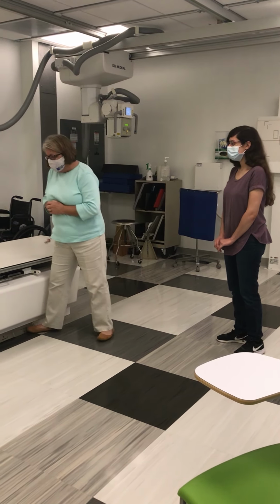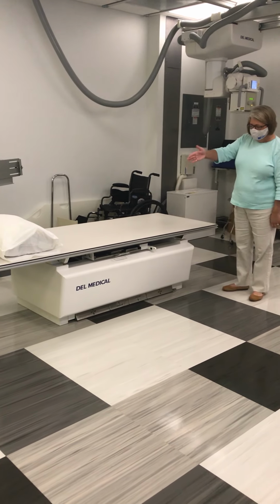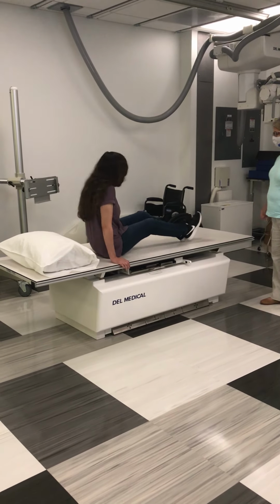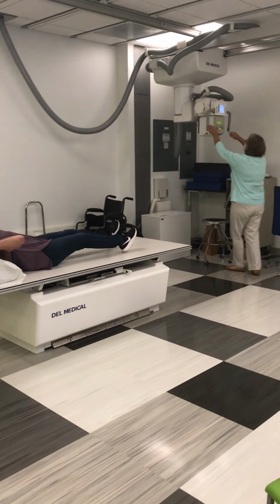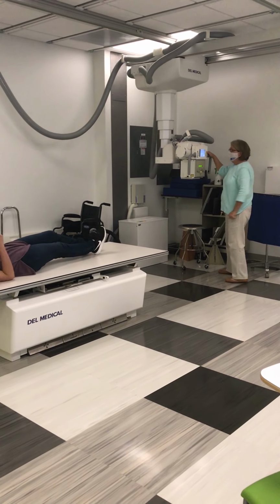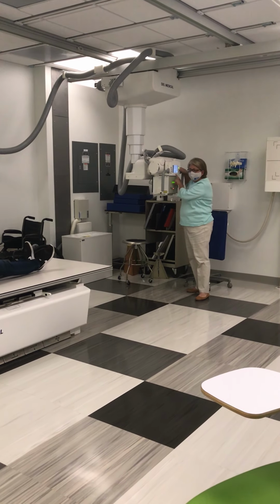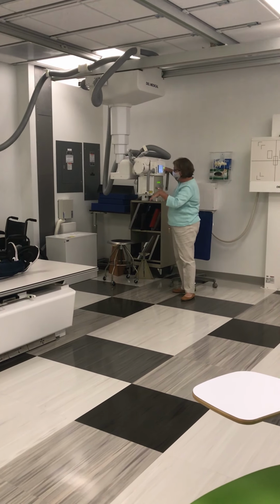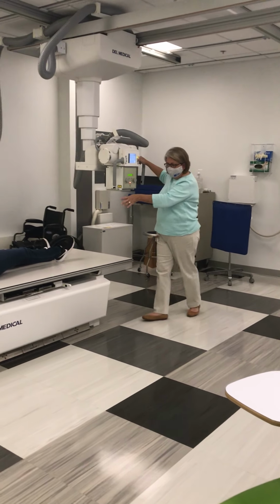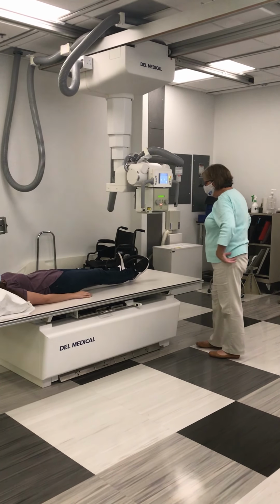I want to make sure that my table is lowered completely for patient safety. Ma'am, if you would, lie on the table on your back with your head on the pillow. I'm going to bring my tube over. Getting my tube in transverse detent. That means that my central ray will be centered to my bucky, which in turn means that my central ray will be centered to my image receptor.